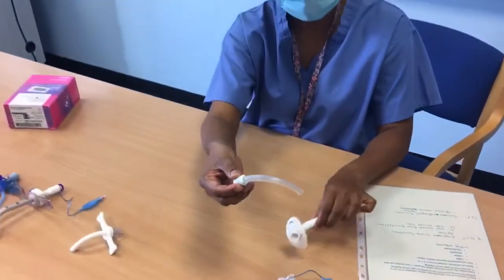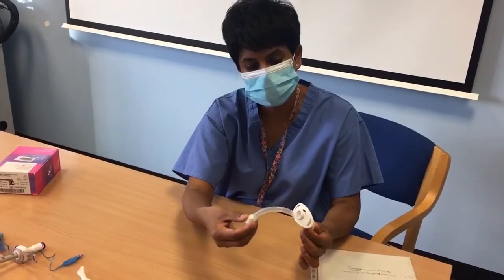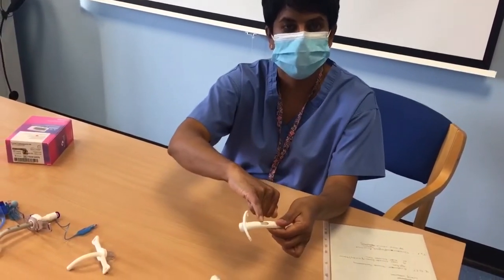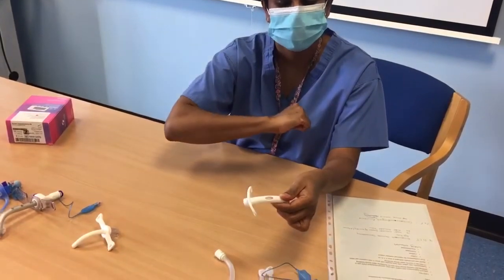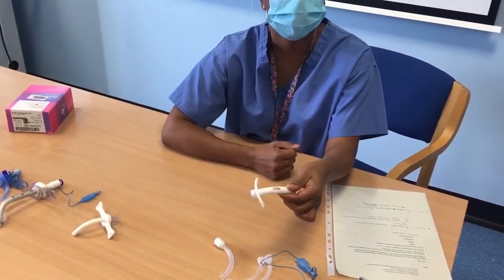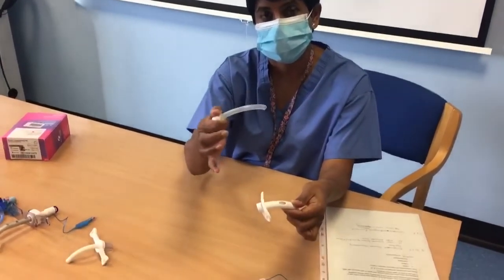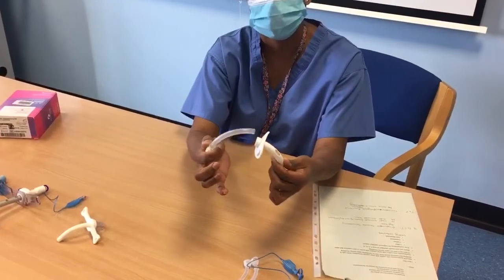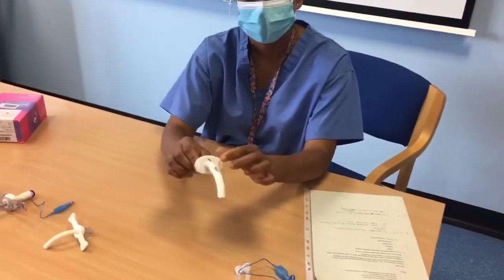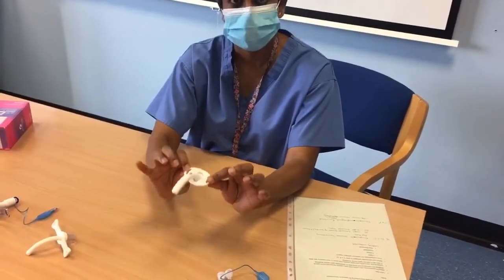Because of course if we were to suction our patient with a fenestrated inner cannula, the suction catheter may end up going through the fenestration and damaging the surrounding tissues. So always a solid tube with no fenestration with these tubes when you're suctioning. Okay, so that is our Shiley. These are latex free.